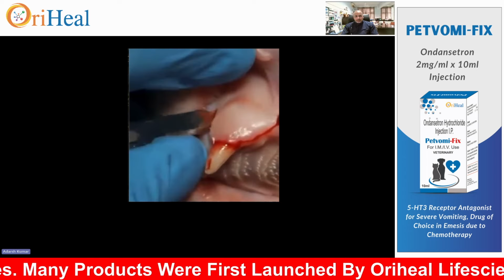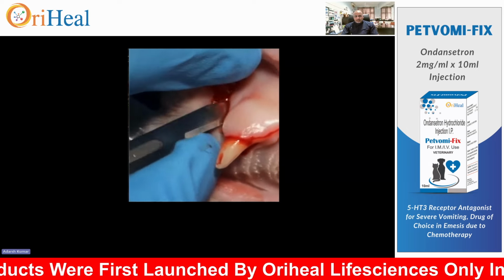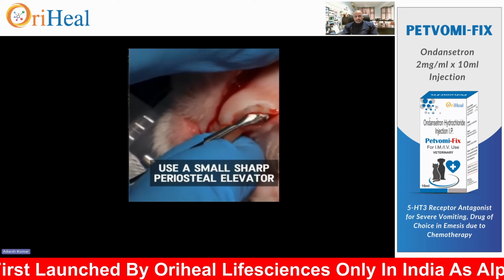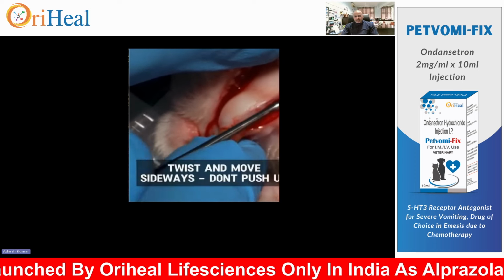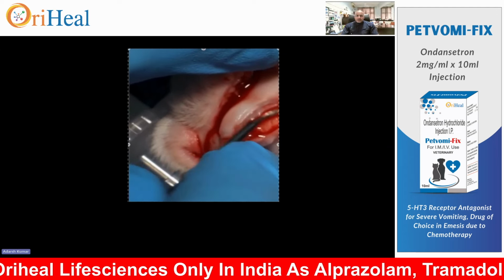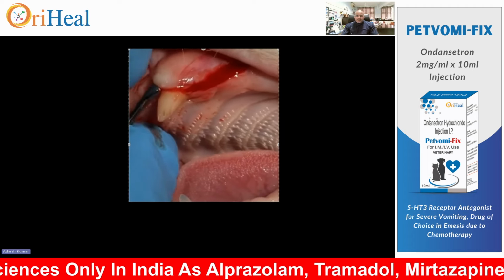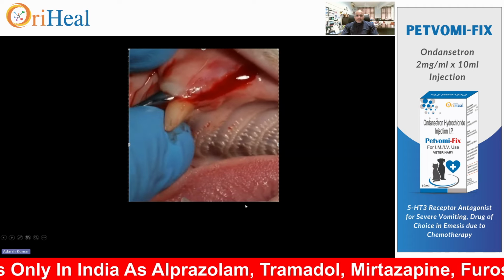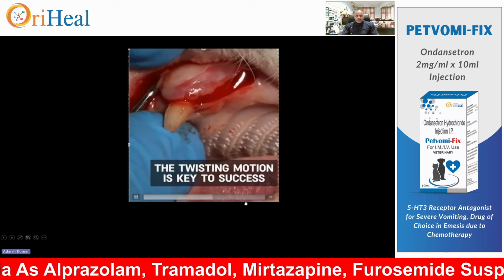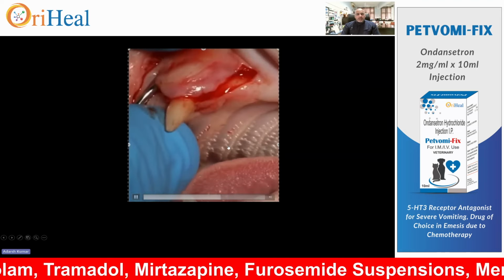So the other incision is given on the side. The flap is released. Look how gently you can use the periosteal elevator and very gently try to first undermine the flap, go towards the other side, release it gently, right? With a twisting motion. Don't thrust towards the apex side. You have to be very gentle and twisting. Okay.